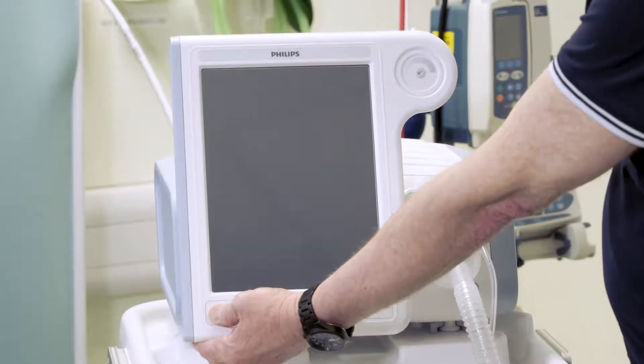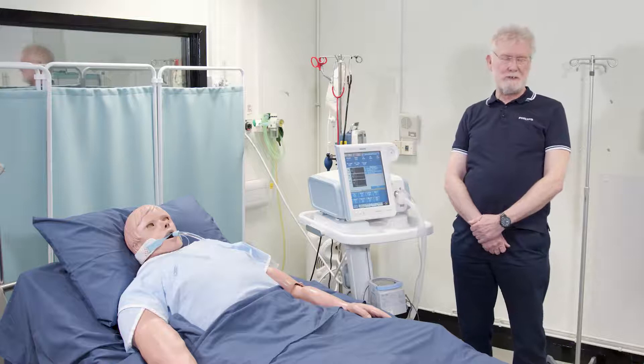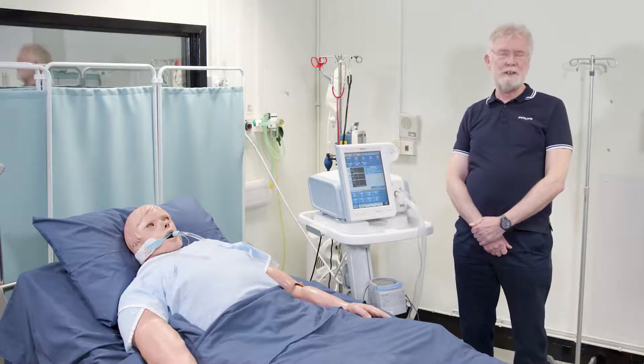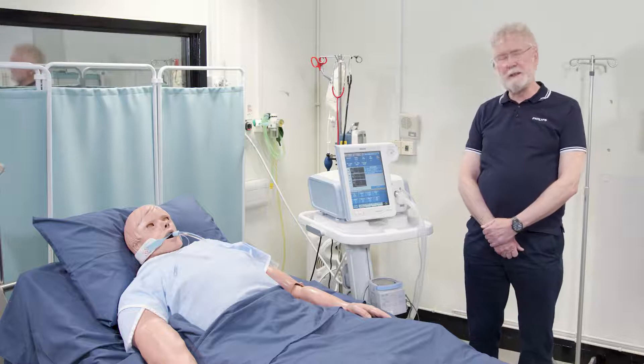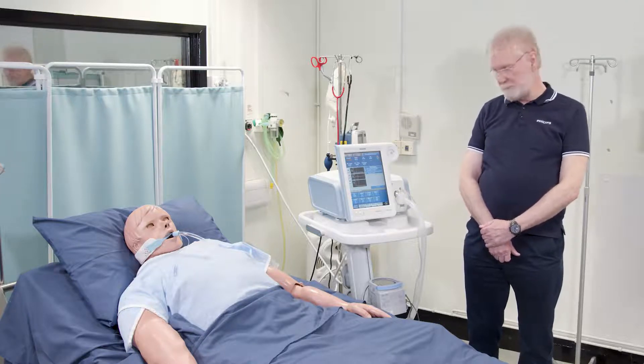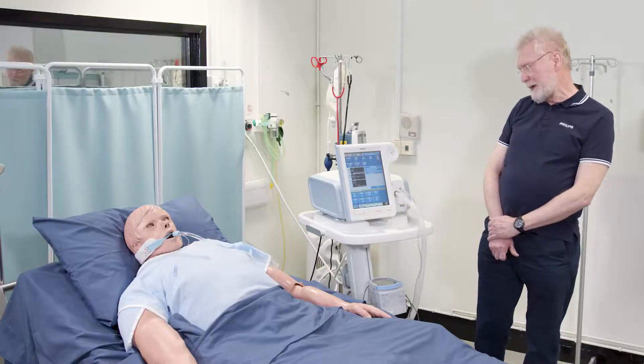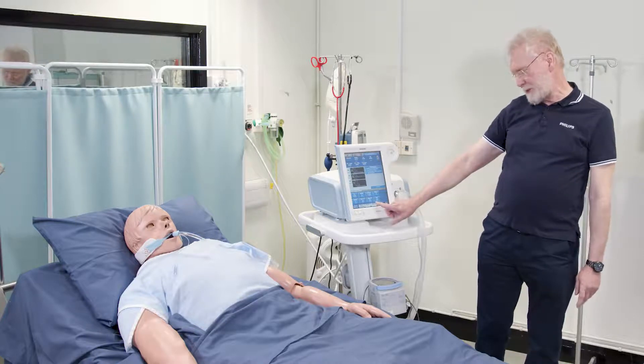Your on/off button is down here, and if I turn it on it will power up. There are no preset checks in this device and there are no default settings. So a key thing to always remember is that whenever you turn this device on you should always check all the settings and all the alarms each time. The machine asks you for two pieces of information when you switch it on, which you will answer in the menu.